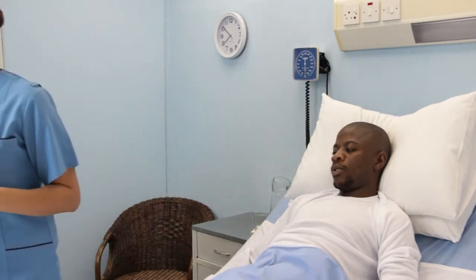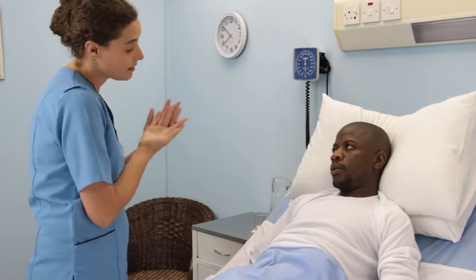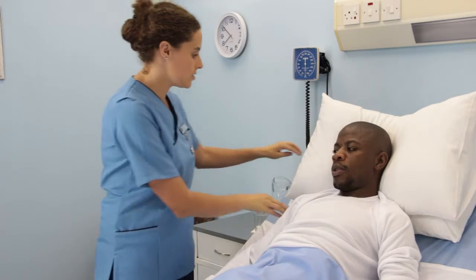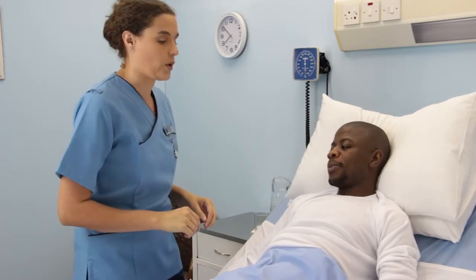Perform social hand hygiene before leaving the patient's room. Ensure that the patient is covered and comfortable. Kindly thank the patient for their assistance. Place the call bell and other necessary items within the patient's reach.